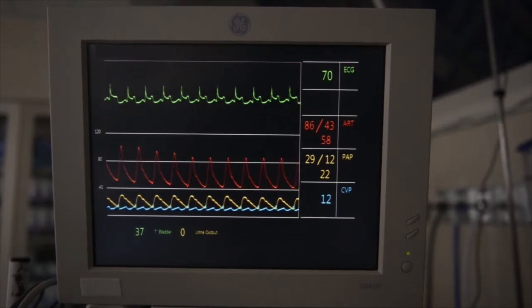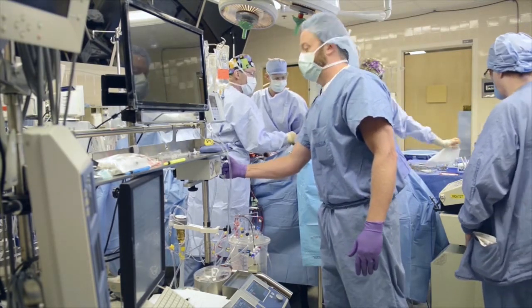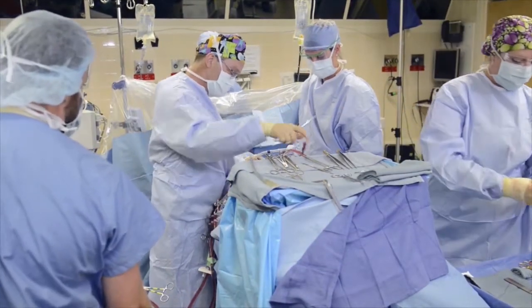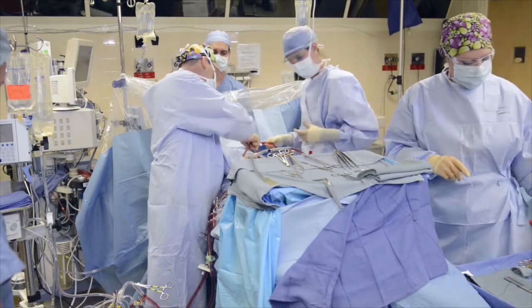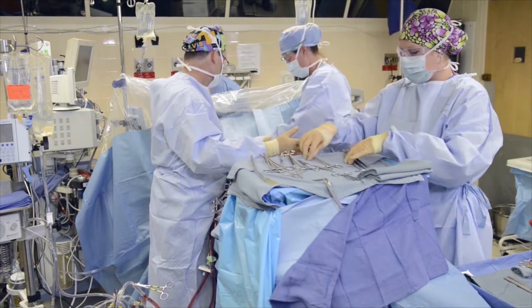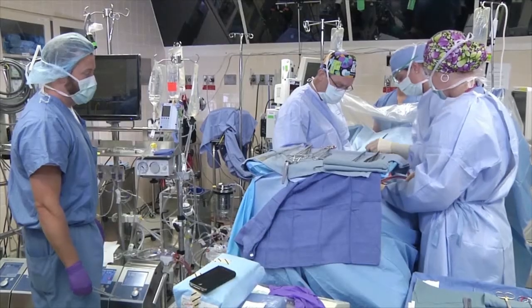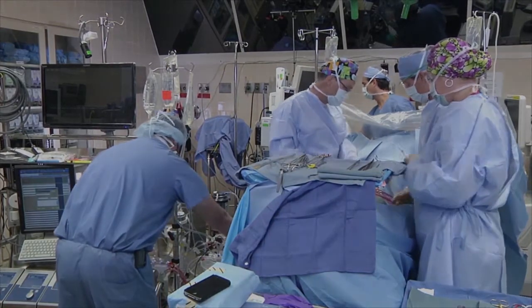Looks like the blood pressure's coming up. Let me know if you see a wire in the true lumen in the aorta. I do see a wire — it looks appropriately placed. Get that arterial line divided. Can we clamp? Heavy scissors. Go back on in the groin. Cool to 18 degrees. Ventilation's off.